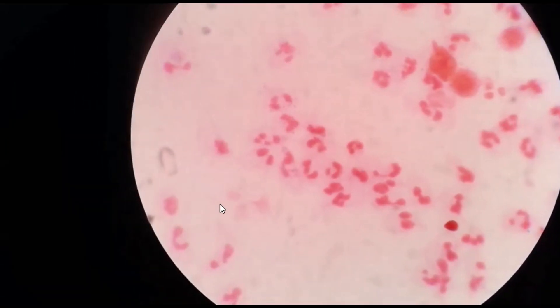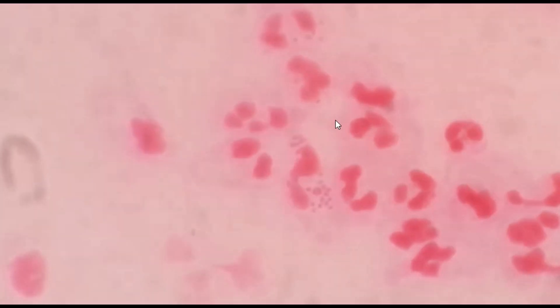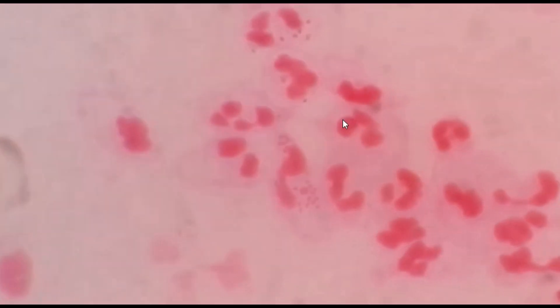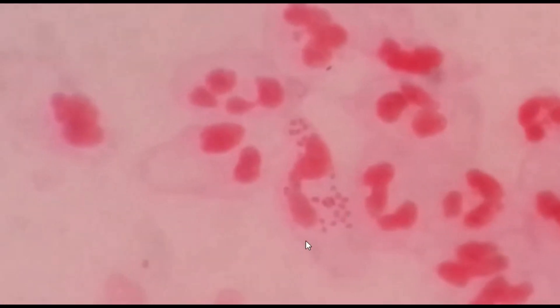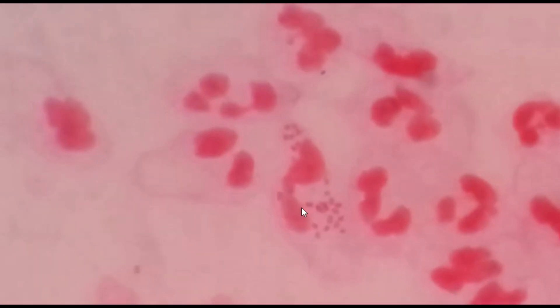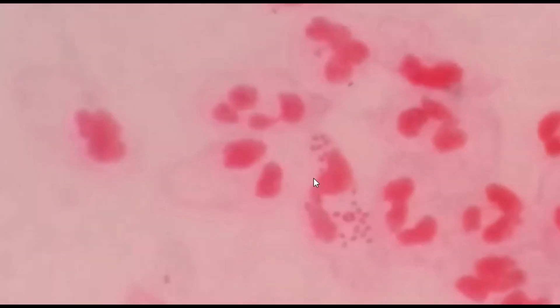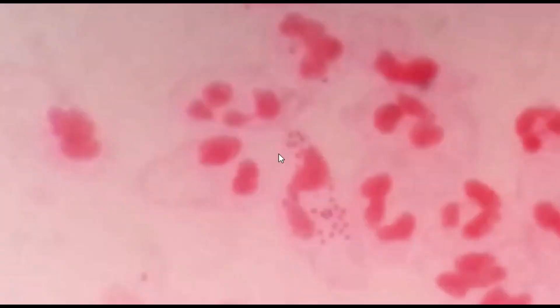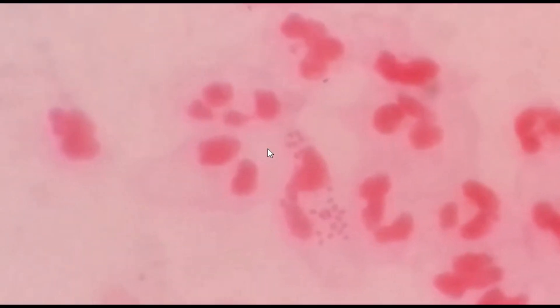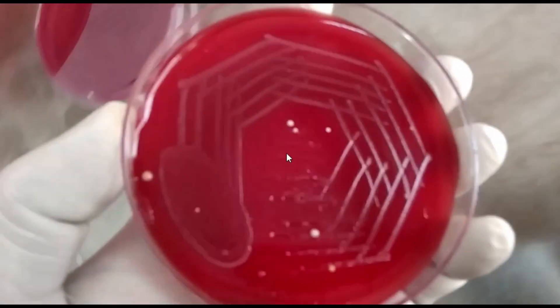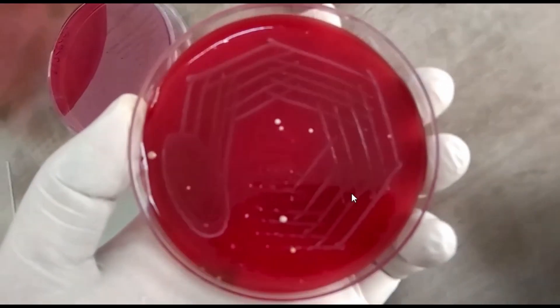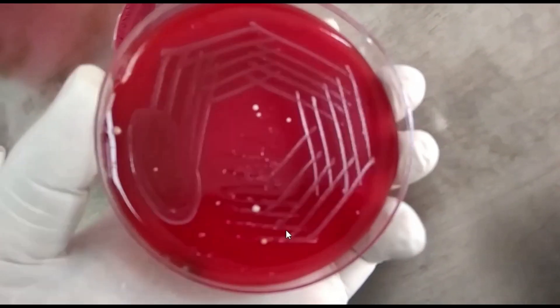After performing gram staining from this slide, we got this type of structures. Here you can see pus cells — there are so many pus cells — and here you can see gram negative diplococci intracellular, and also extracellular was seen.